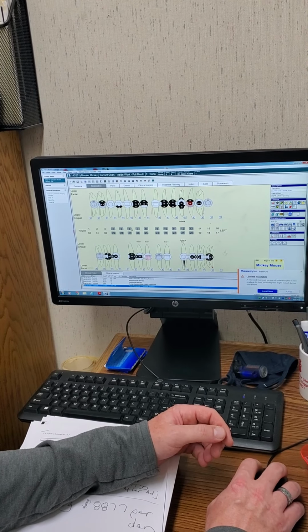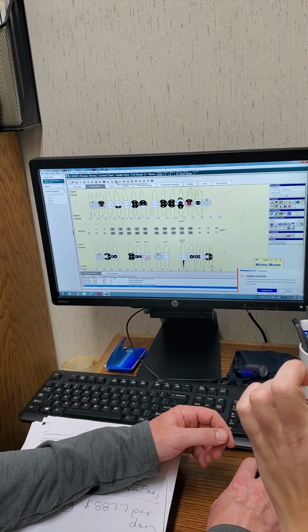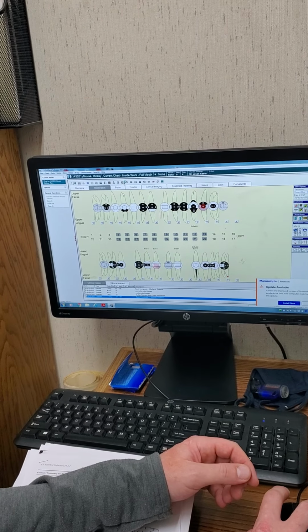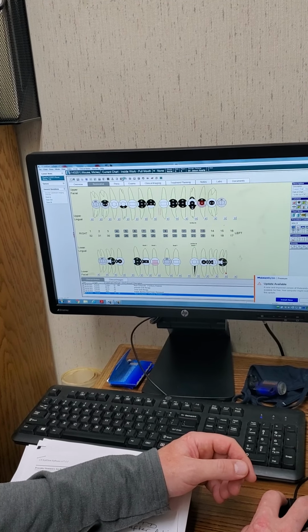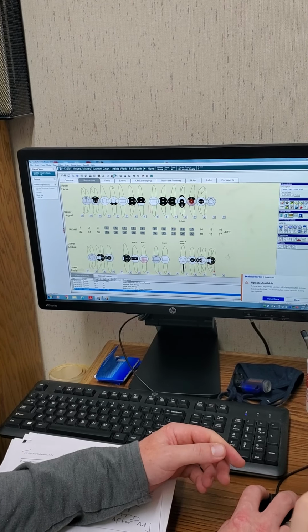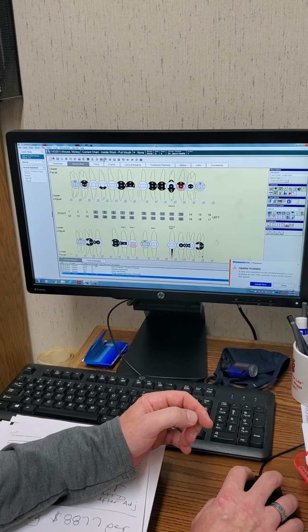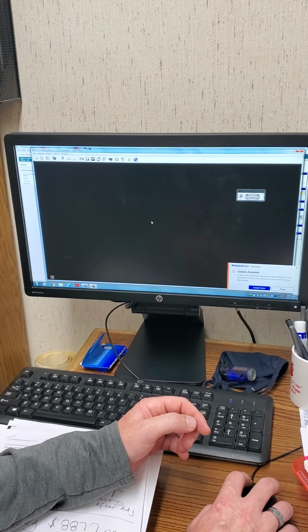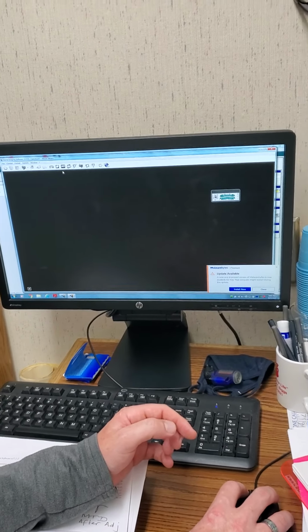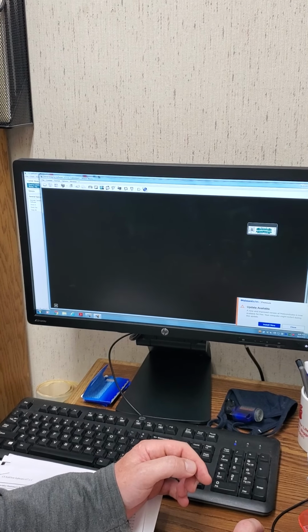So this is the chart for Mickey Mouse. You're going to click the Carestream Dental Imaging Software button. And you can use this button to get to any x-rays anywhere on any chart. Since we're doing a CBCT, it's the 3D x-ray. We're going to select the 3D button.